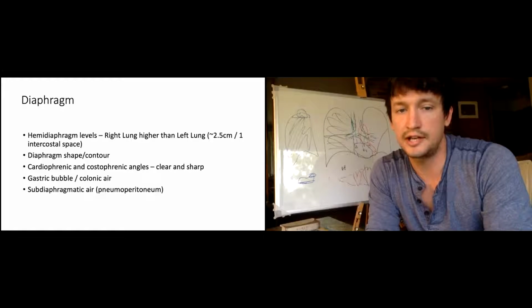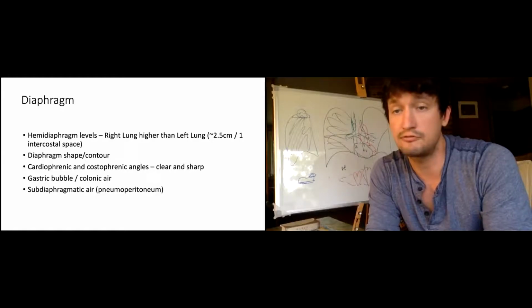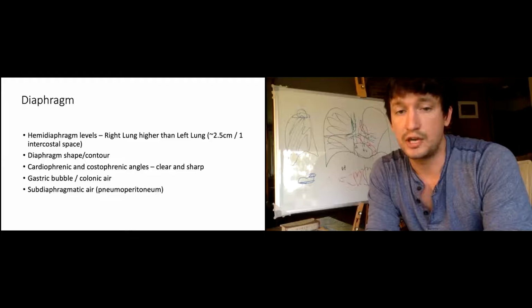And then you look at the diaphragm. You look underneath the diaphragm, make sure there's no air underneath. Next slide.